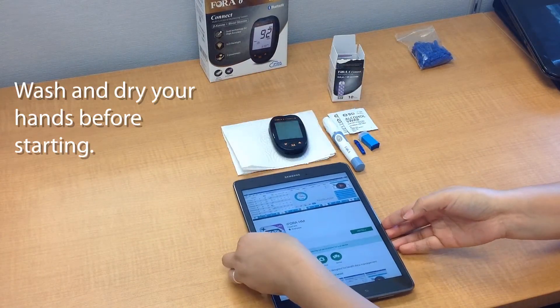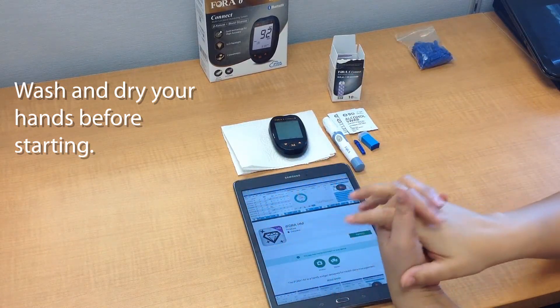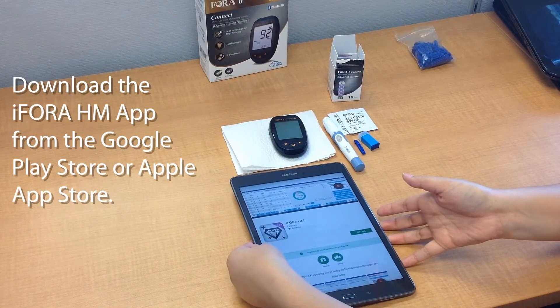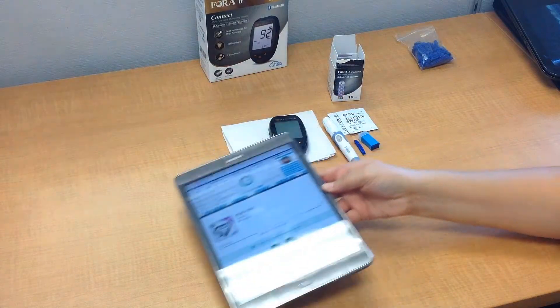Before starting this whole testing procedure, please go ahead and ensure that your hands are fully washed and dried so that we can avoid any kind of contamination. You also want to download the app ahead of time, either from the Google Play Store or from the Apple App Store.